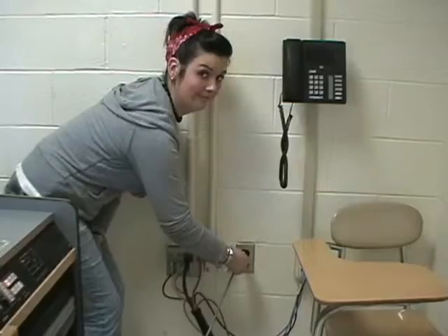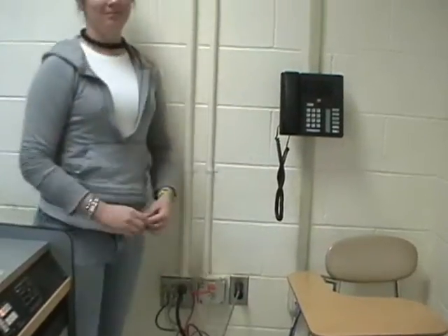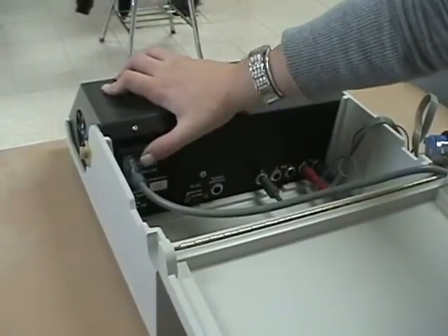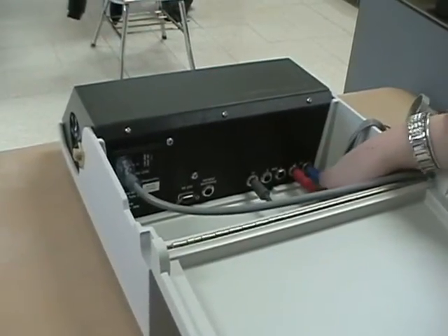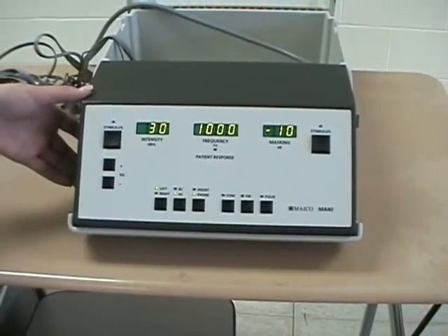First, I'll show you how to plug in the audiometer. This is how you plug in the audiometer. Pressing this button right next to the power cord will turn on the audiometer. Right here is the plugs for your bone conduction headphones and the air conduction. Red means right, blue means left. Now your pure tone audiometer is powered on.